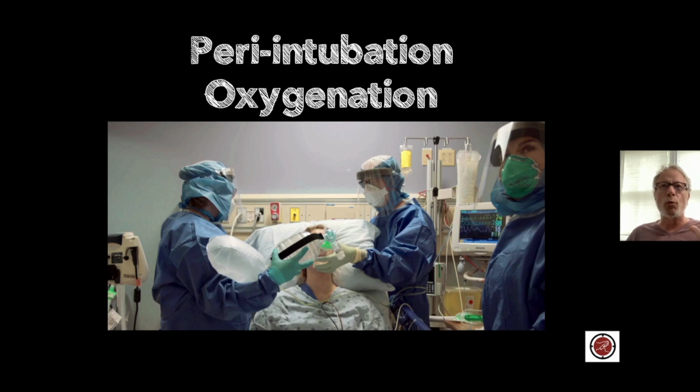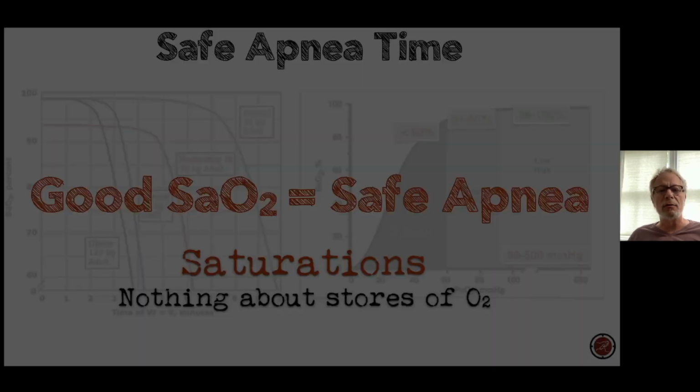What I'm looking at is the waveform capnography, because that gives you breath-to-breath information. Your sats are a reflection of what's been going on, but what gives breath-to-breath information is that waveform, and it tells me about my mask seal, whether I've got a good seal or not, right? And you're going to learn what a normal waveform shape looks like, that top hat appearance. That's what you want to look at and get used to.